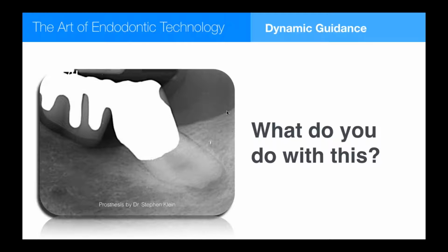We had cases like this, a severely tipped second molar. It's been restored with a brilliant 5-unit bridge 2 months before. The tooth becomes necrotic, and this whole restorative effort is going to be lost if I can't find the canal. There's no pulp chamber. The crown is 16 millimeters high, so I'm going to cut 16 millimeters into this tooth before I have a clue as to whether I'm on track to find the canal or not.